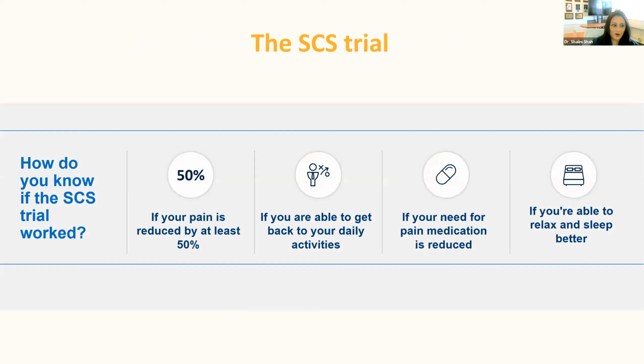So let's talk about the process. As I said, we're going to send you home with a trial. You'll come into the clinic. Typically, your pain physician will put in the leads and map it out, and we ask you a lot of questions. Is this over the area of your pain? No, doc, can you move it more left? Can you steer it more right? A little bit higher, a little bit below the buttocks, maybe a little bit on the outer thigh. We tailor it to what you need and where most of your pain is. And then we send you home.